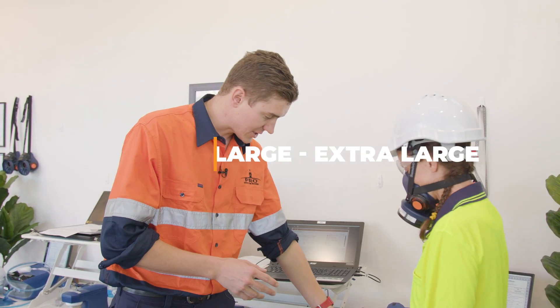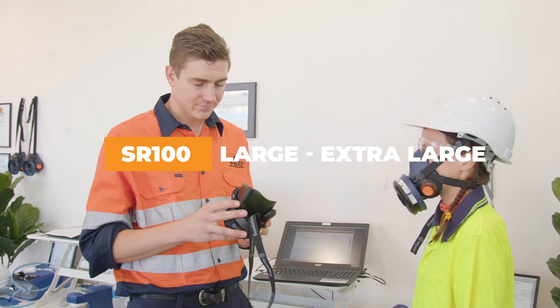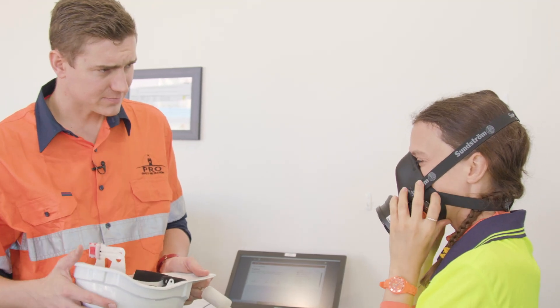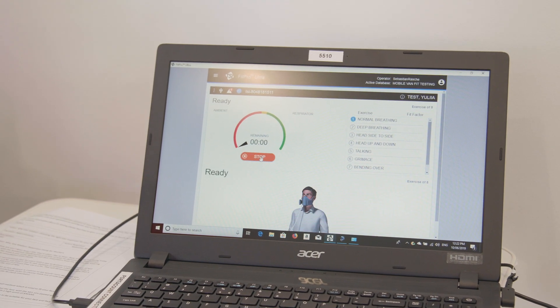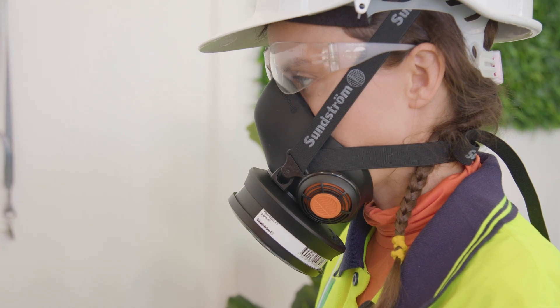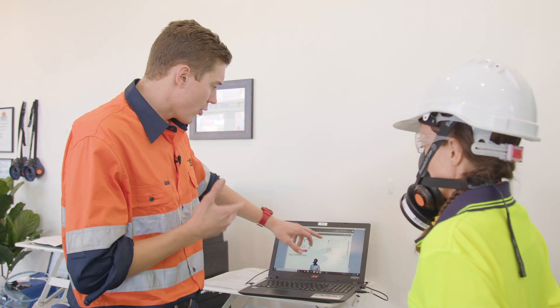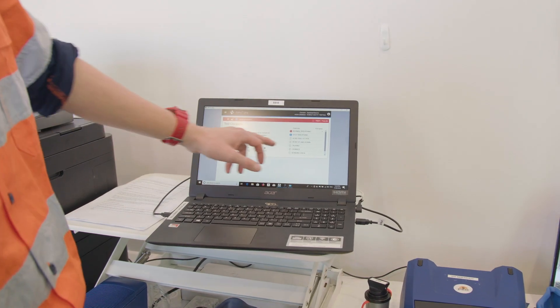We're still going to test you on a large extra large just to prove that face sizing and respirators does matter. Now how does that feel on your face — does that feel way too big? So we'll start that nice normal breathing. Basically you've failed the exercise, you've only scored a fit factor of seven.